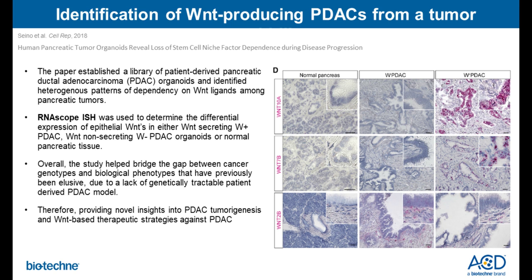So using this technology, they were able to understand the expression signature of Wnt ligands within these different pancreatic tumors and study the dependency of these tumors on the Wnt signaling pathway, giving them novel insights on the tumorigenesis of pancreatic cancer.